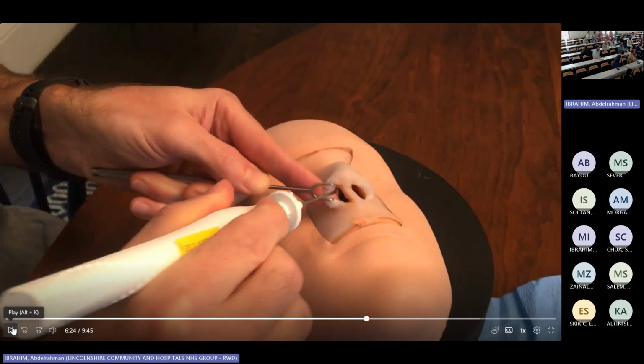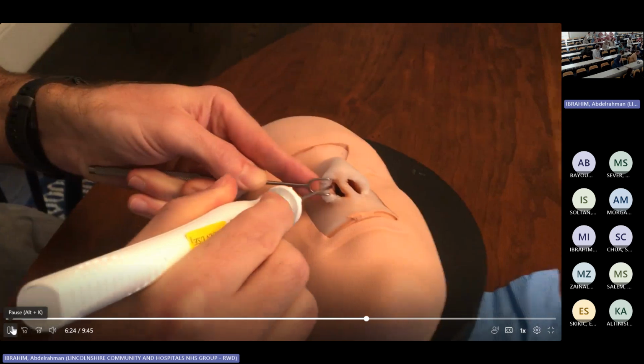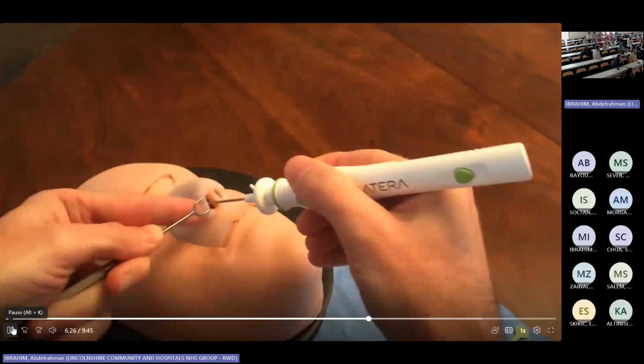Is it medial to the cartilage or lateral? Yeah, medial to the cartilage. So it's between the mucosa and the cartilage. You can say that it's the skin of the vestibule, because still you're going to pierce the skin. You're not yet into the mucosa. It will be later to the mucosa. So it's going in the mucosa between the lower lateral cartilage. Yes. And then when you turn it, you go between the lower lateral and the upper lateral. So you become lateral to the upper lateral cartilage. Yes. And then below the skin, then you turn to plane up the lateral wall.